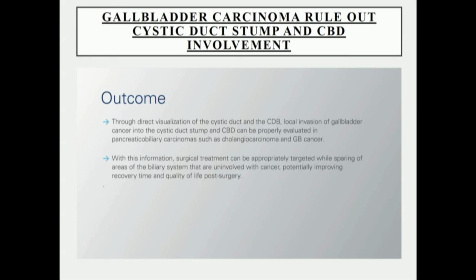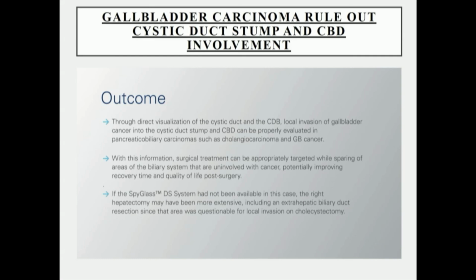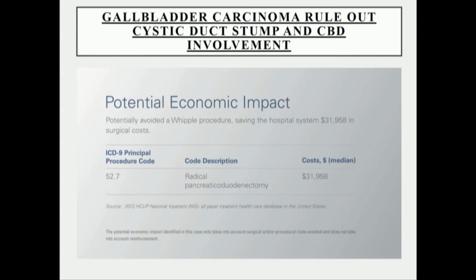So again, another example of how anytime there's main duct disease, left main, right main, common hepatic duct, or common bile duct, there's a potential for involvement. That's really the key role for cholangioscopy. And the vascular structures are still well defined by the old algorithm of using CT scans and or EUS or other cross-sectional imaging, but we never had these kind of views before. And so to me, that's what's really revolutionary about the preoperative staging for main duct disease.